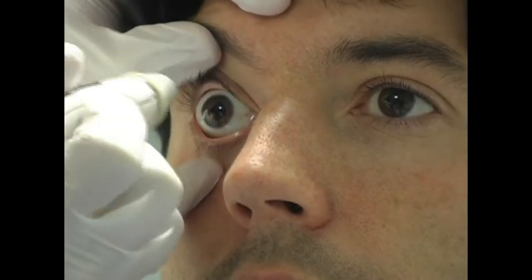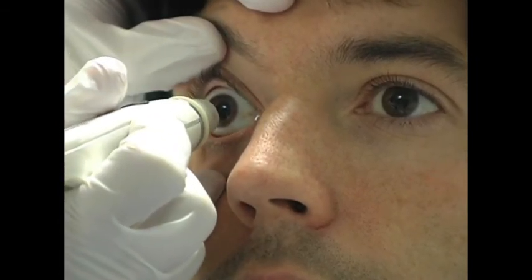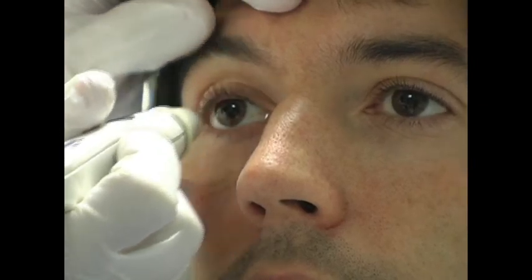If a patient's eyelids must be held open for testing due to involuntary squeezing or eyelid edema, make sure that you do not push on the eye itself, as this will falsely raise the IOP measurement. In these instances, try to hold the lid against the bony orbital rim to avoid putting pressure on the globe.